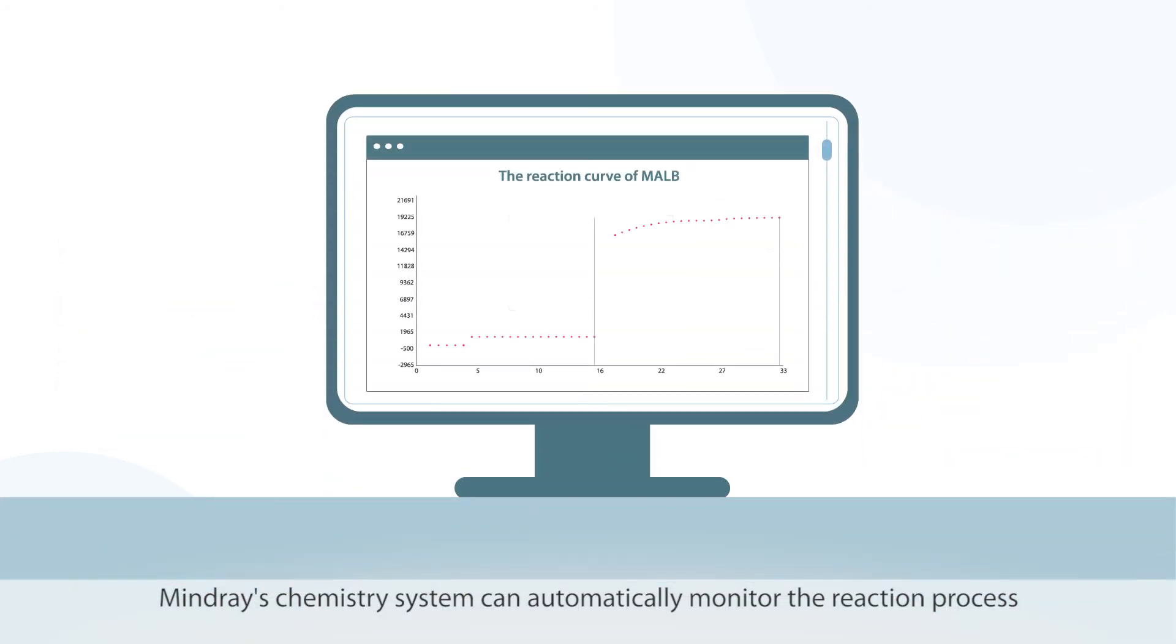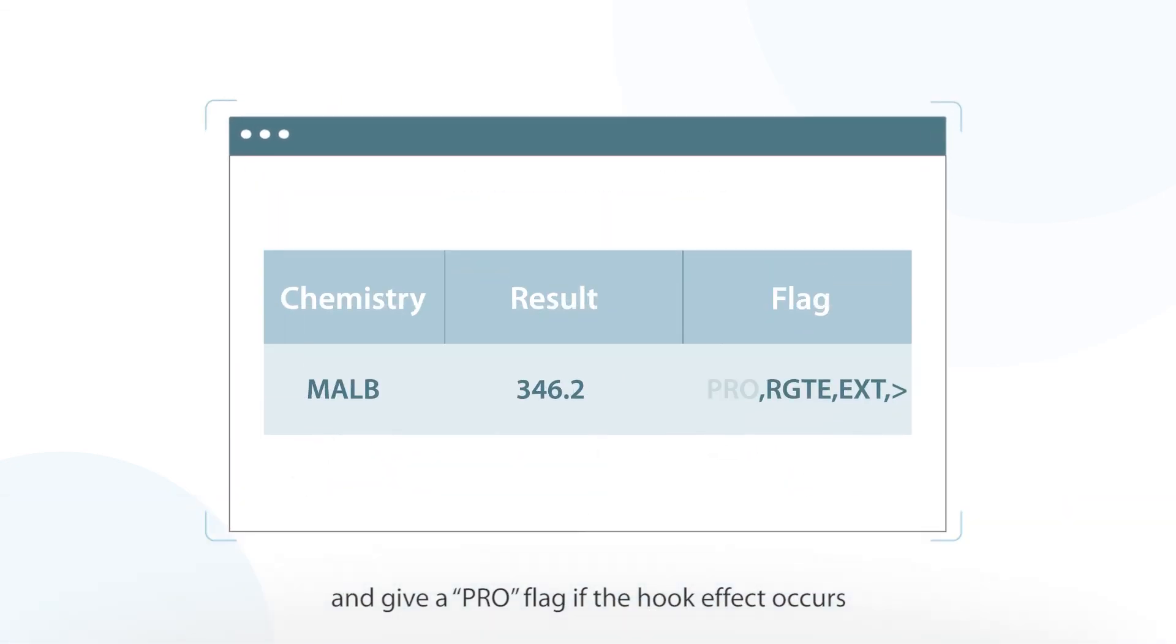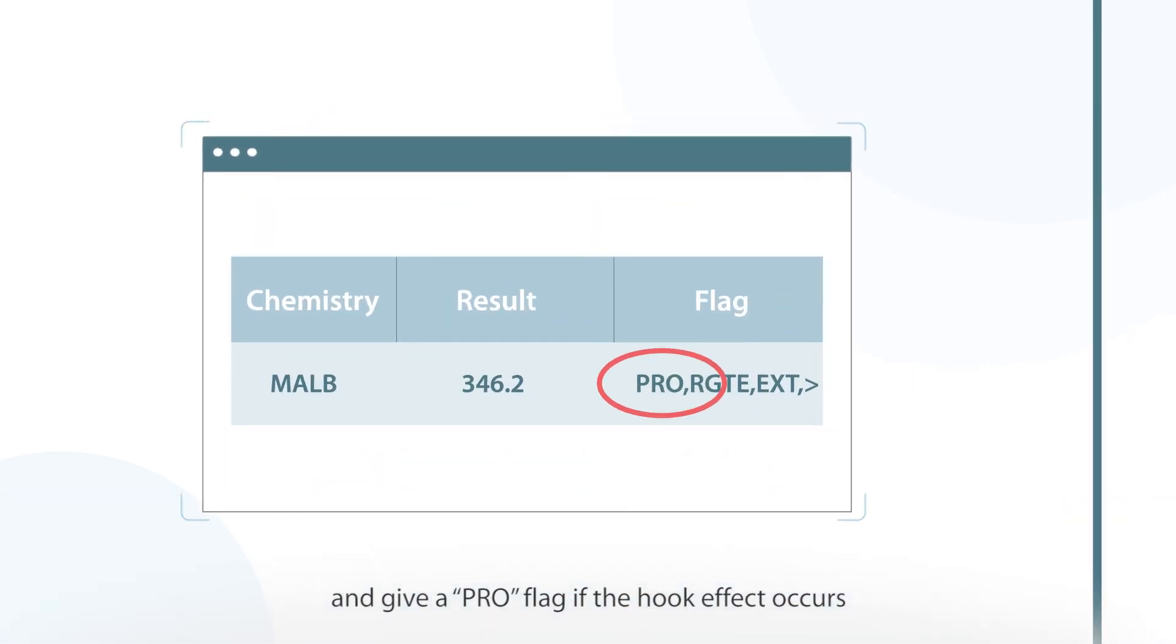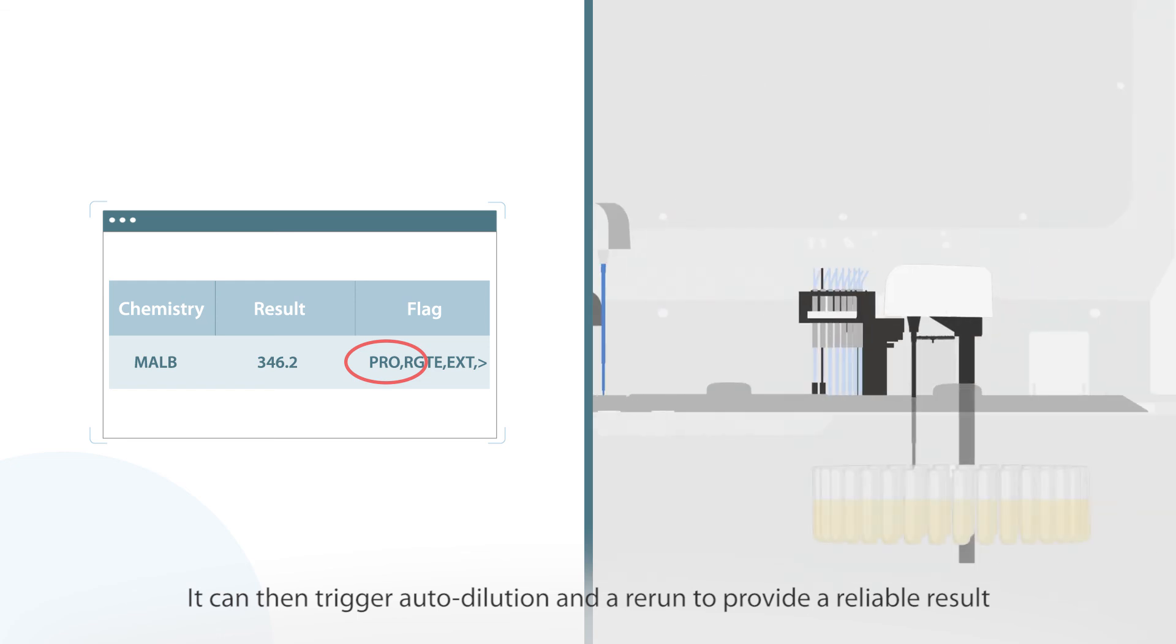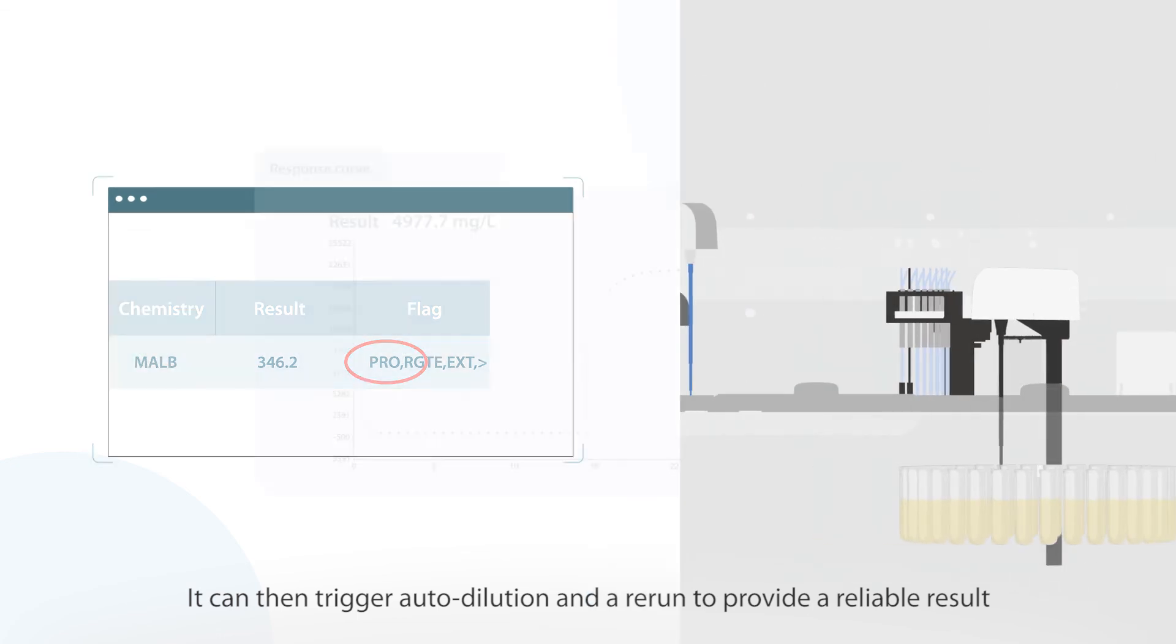MindRay's chemistry system can automatically monitor the reaction process and give a PRO flag if the hook effect occurs. It can then trigger auto dilution and a rerun to provide a reliable result.